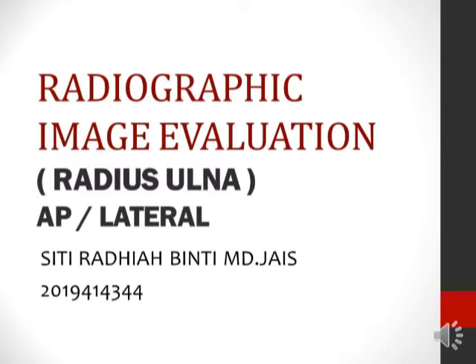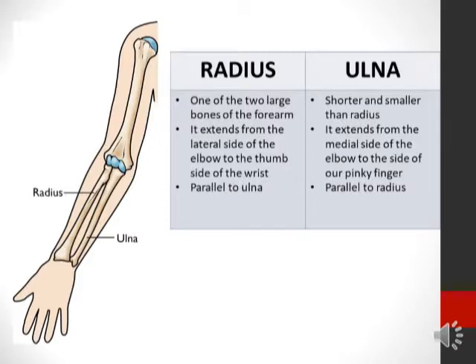My name is Siti Radhiah, and today I am going to explain and evaluate two radiographs, which are AP and lateral radius ulna. So first of all, I would like to explain what is radius and what is ulna.